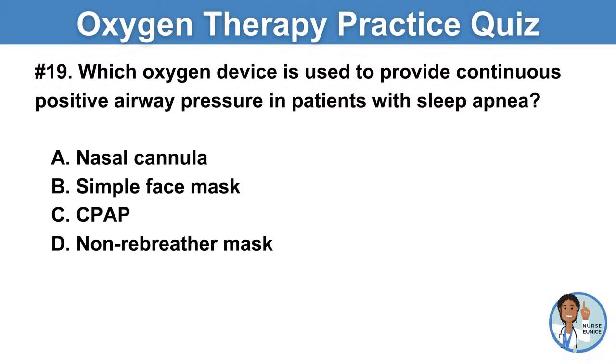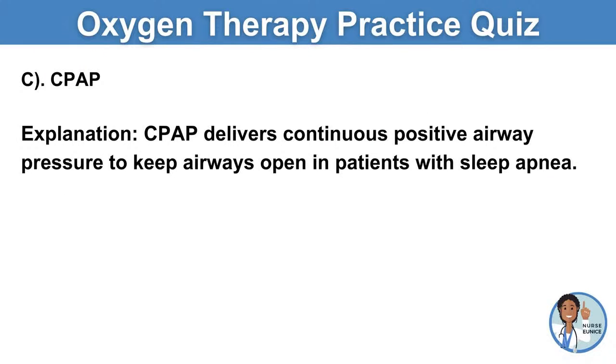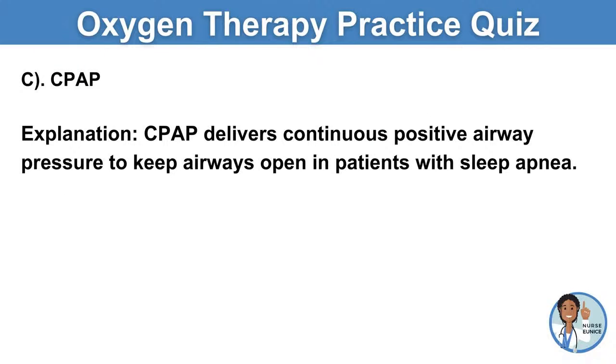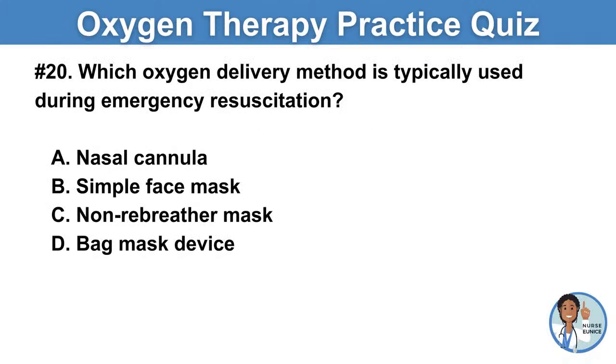And for this one, everybody, if you chose C, you are correct. So CPAP stands for continuous positive airway pressure. And we usually prescribe that for patients with sleep apnea. So they will put that on before they go to bed.